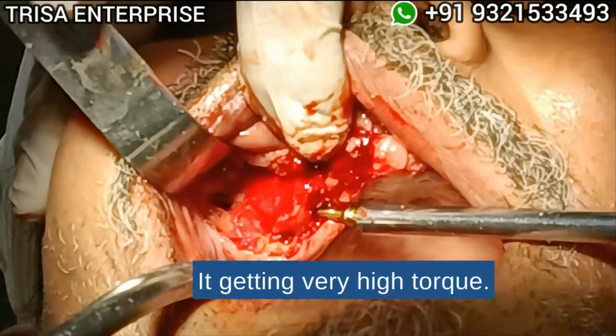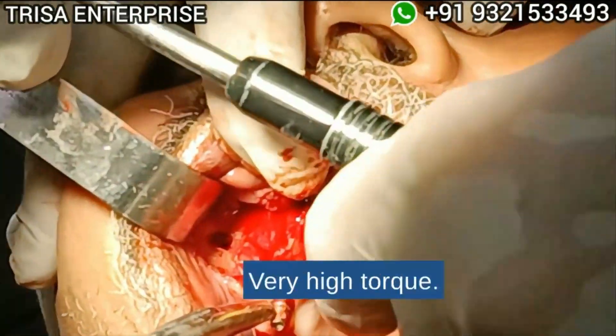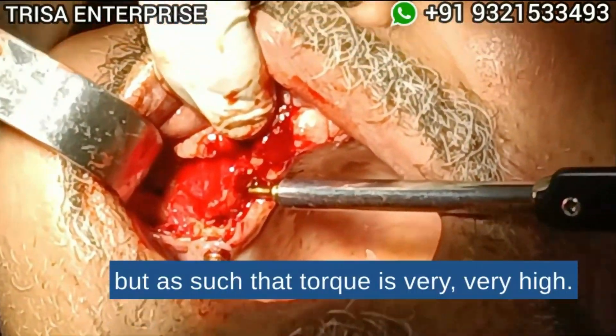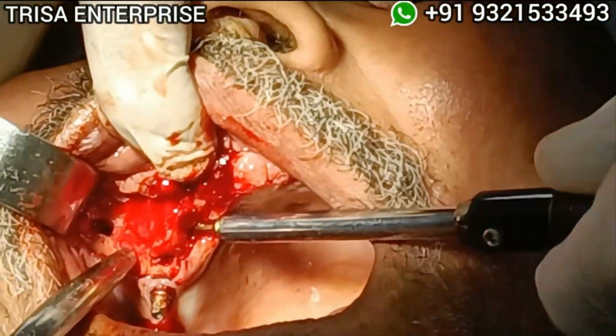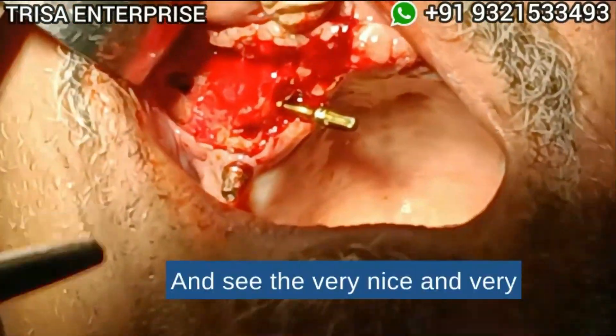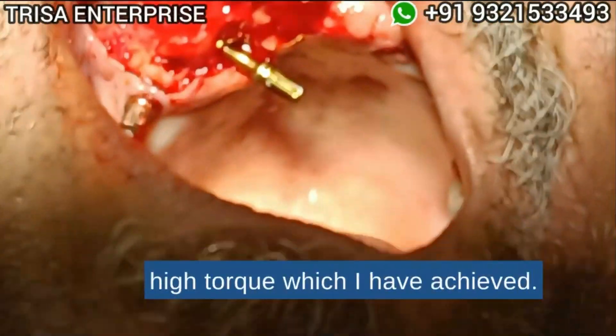Getting very high torque — this is because of the iso-elasticity of the implant, but as such the torque is very, very high. You can see the very nice and very high torque which I have achieved.